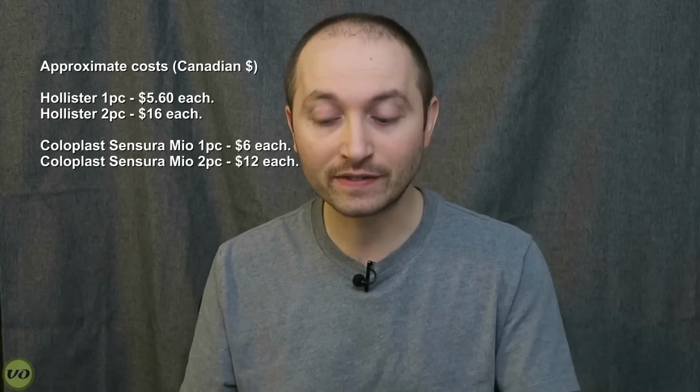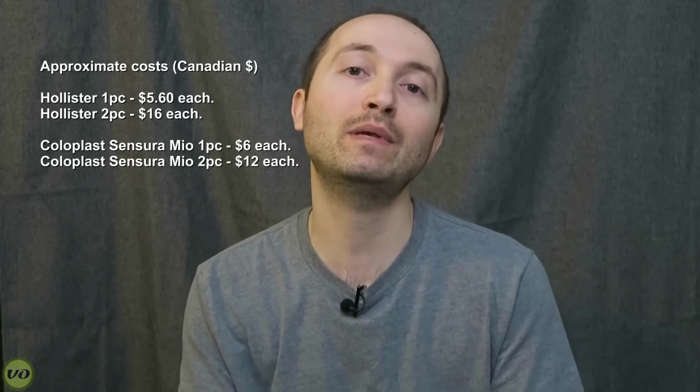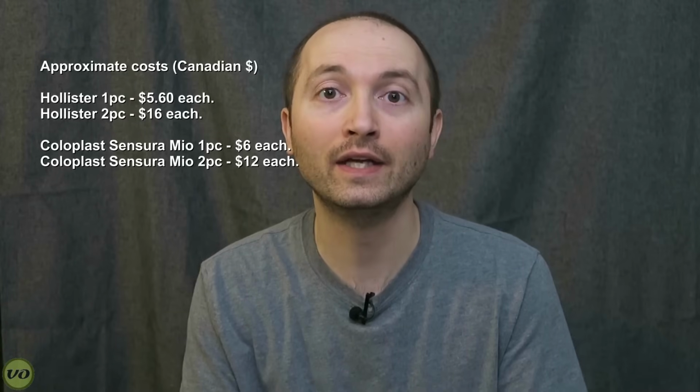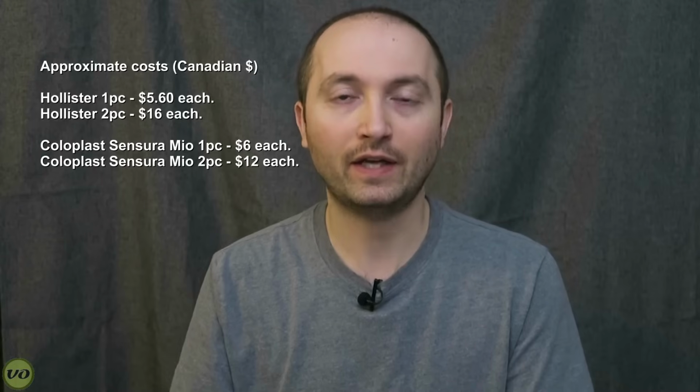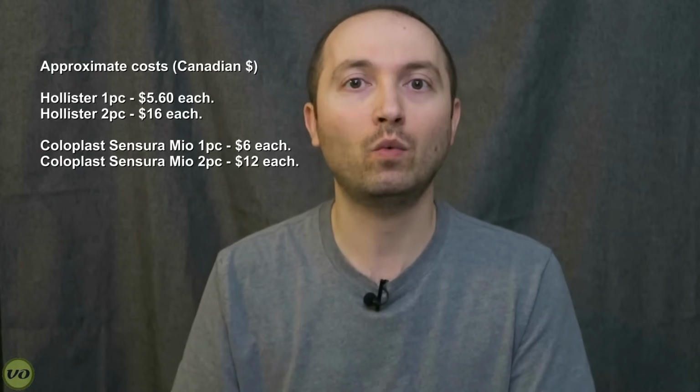Another thing about one-pieces is that they tend to be less expensive than two-piece systems. And for some people who are paying for supplies out of pocket, those dollars here and there will add up. So that's another thing that I would say is a benefit of a one-piece.